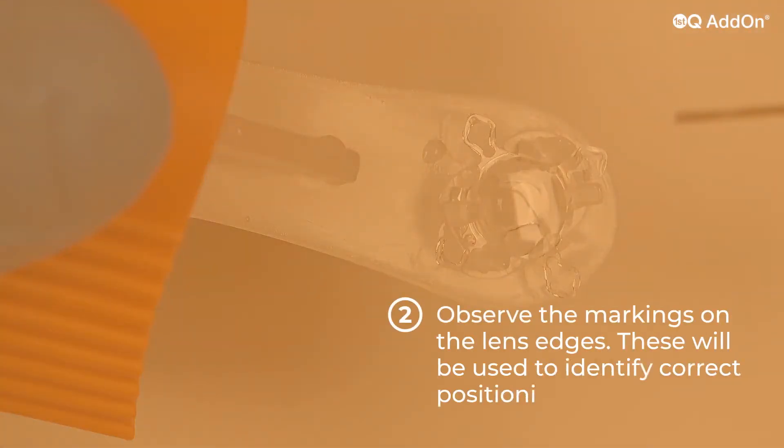Observe the markings on the lens edges. These will be used to identify correct positioning of the lens in the cartridge.